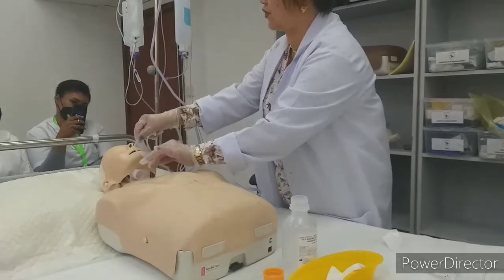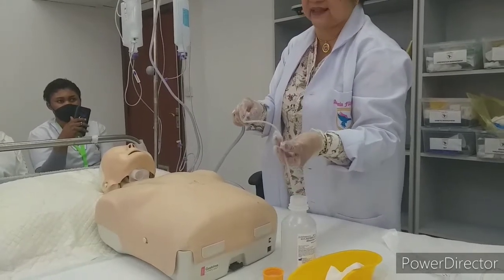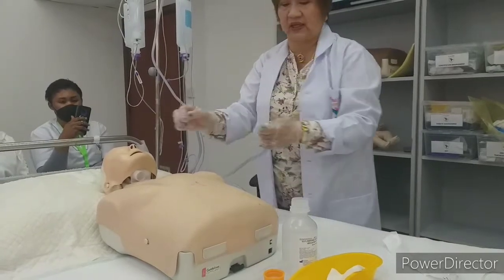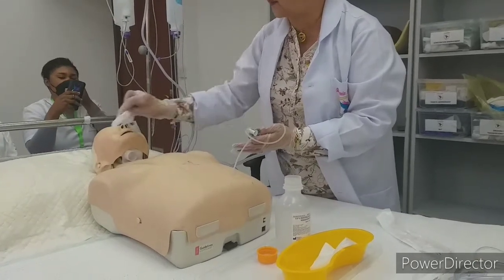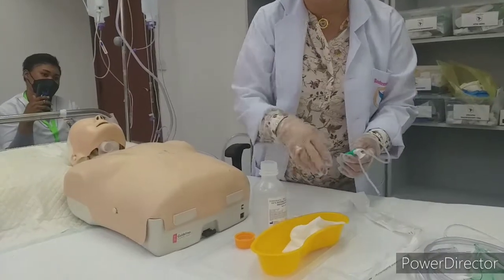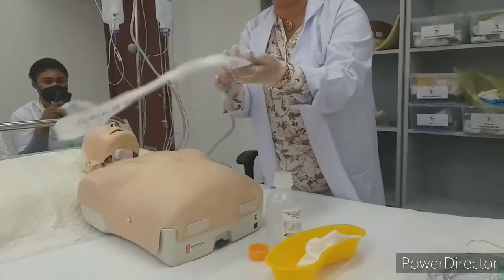Okay? So you can dip this much. Okay? The same, clean, suck in, suck out. Done. Okay, so we are done. Patient is okay. If there is anything from the mouth or the nose, clean the patient with disposable gauze.